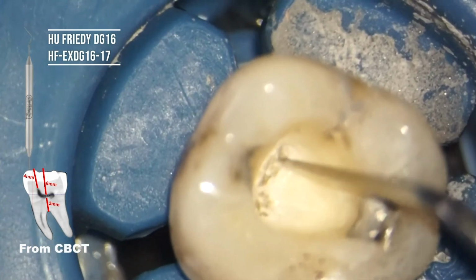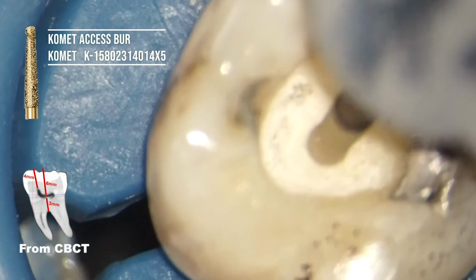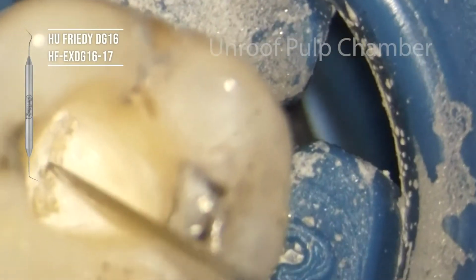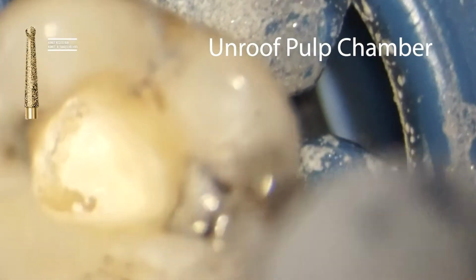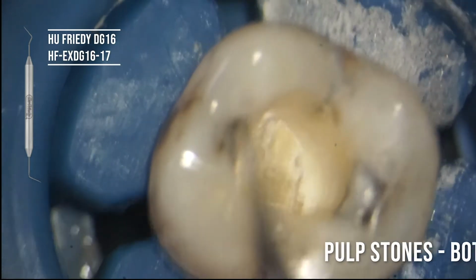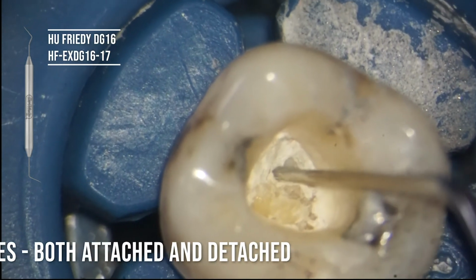I see a detached denticle down there that we're just going to unroof completely and remove. Some of these pulp stones we can easily just flick out with the DG16. Others are bound a little bit more tight, and we've got to use a little bit more aggression. Once again, using the Comet burr, so there's an unattached pulp stone, just flicking that out, and underneath there we'll easily find the orifice of the mesial canals, mesiolingual, mesiobuccal.